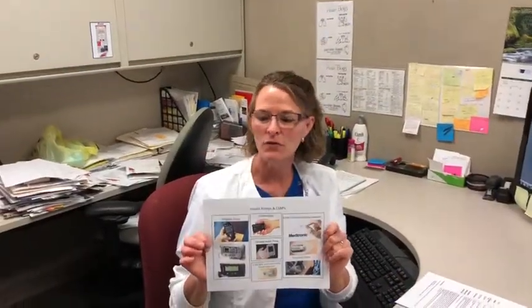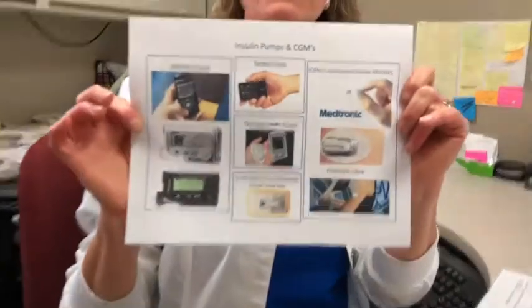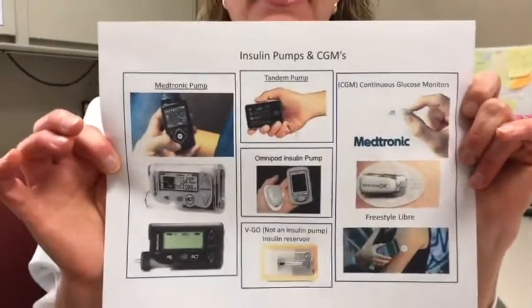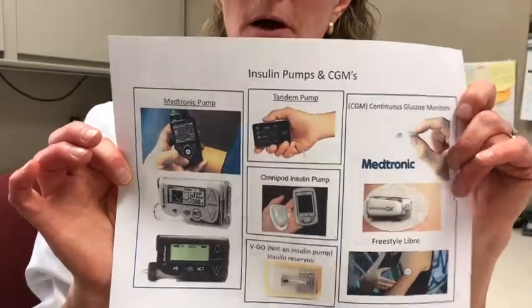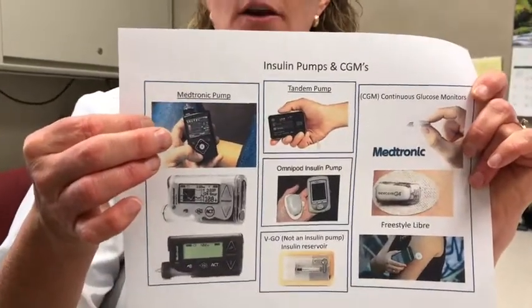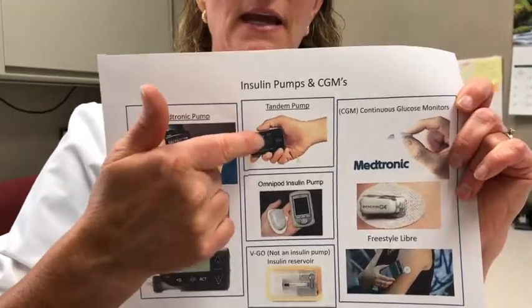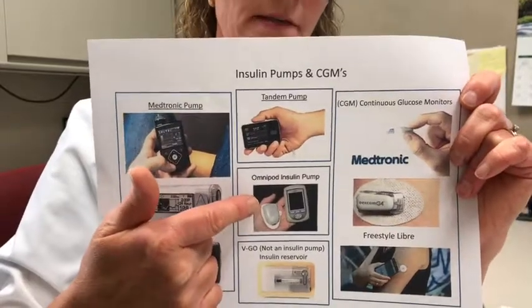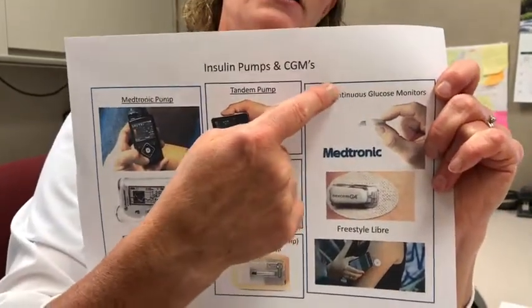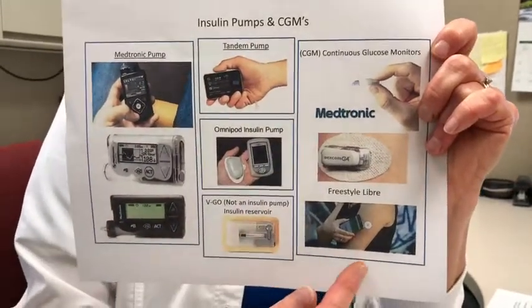I also want to let you know I'm going to have a laminated copy, and your director, Brooke, is going to have a packet and a folder with packets that have the SBAR and this reference guide for insulin pumps. On this side over here, we have all the different kinds of Medtronic pumps. This is a Tandem insulin pump. This is an Omnipod, which is tubeless. These are continuous glucose monitors. This is Medtronic, Dexcom, and Freestyle.